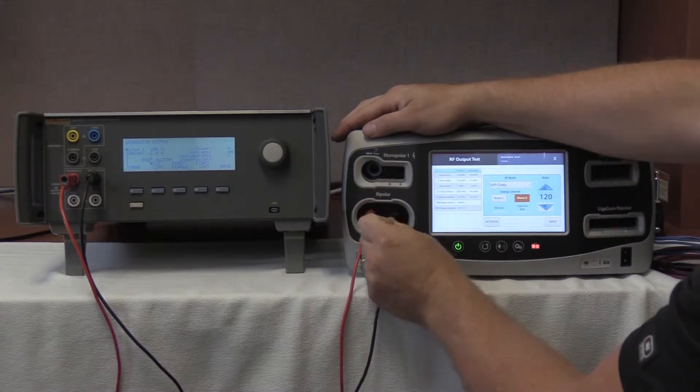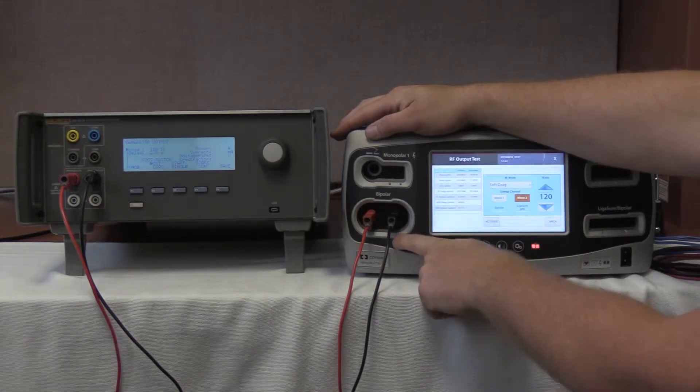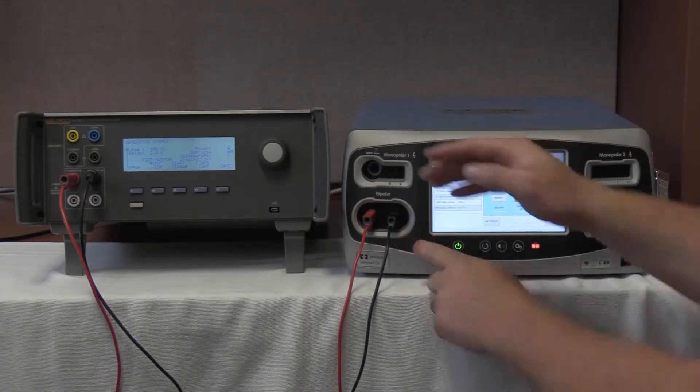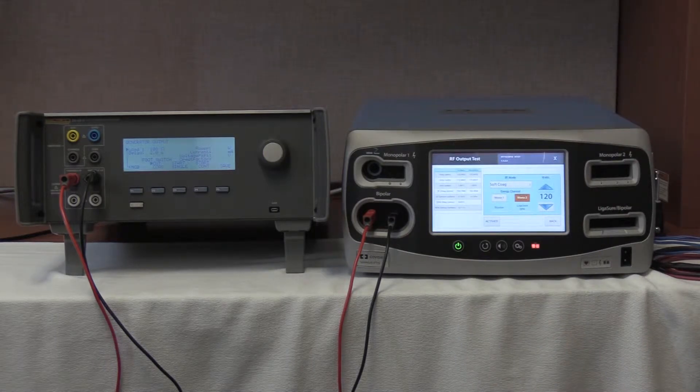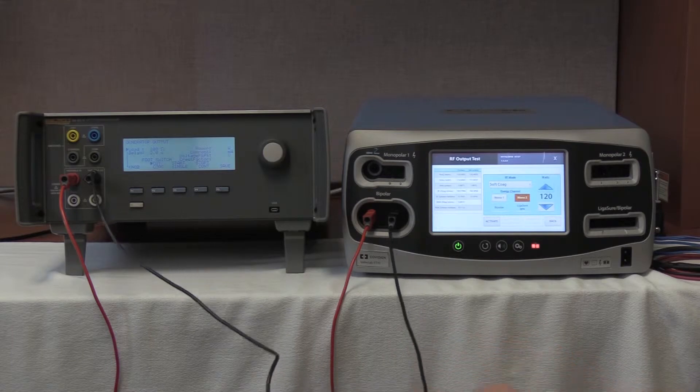When it is plugged in, make sure that the two DIN switches inside the output are completely compressed and activated. That is the cable hookup for the bipolar energy output of the Valleylab Covidien FT10.